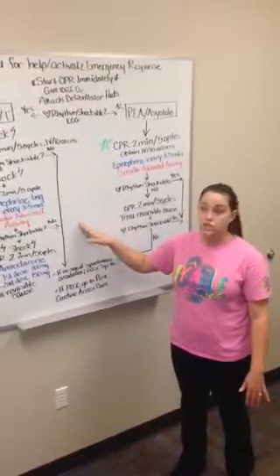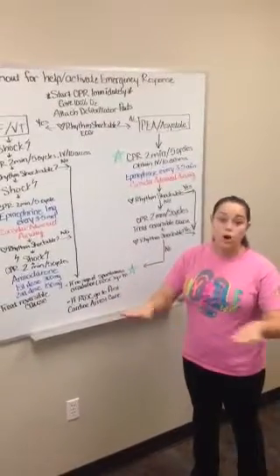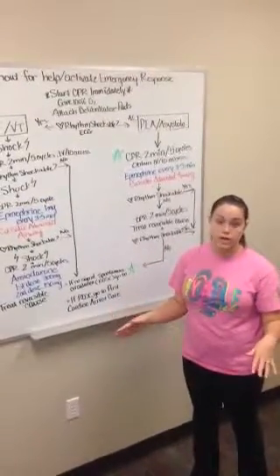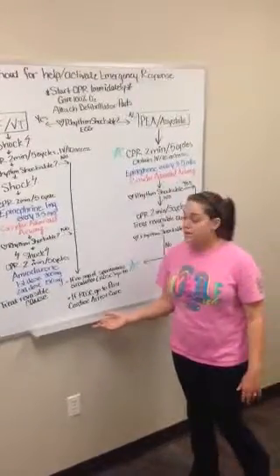Anytime you're delivering a shock, you want to make sure that everyone is clear. I'm clear, you're clear, we're all clear before a shock is administered. The last thing you want to do is take out some of your team members.